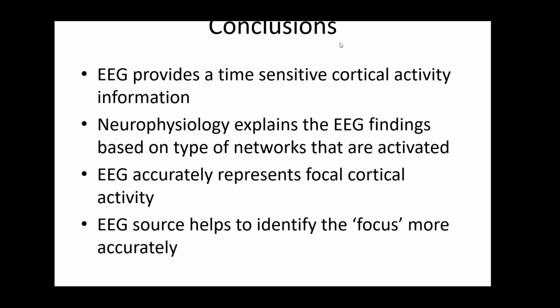The second thing is dipoles are not typically represented in an anatomical location. You typically represent a cortex that is depolarized, and your dipoles typically go deeper into the white matter. So when you see a dipole model, the dipole usually is in the white matter, not in the cortex, because it's the representation of the cortical activity it's aiming at.